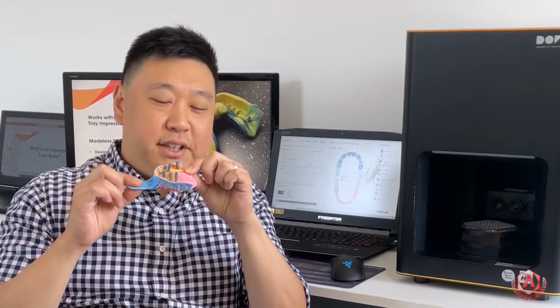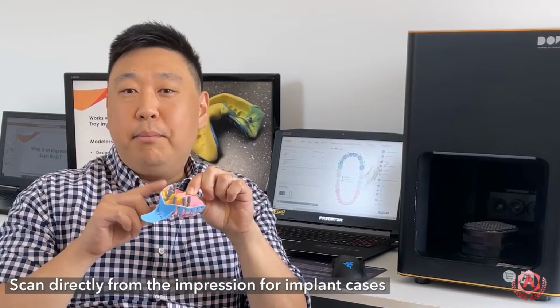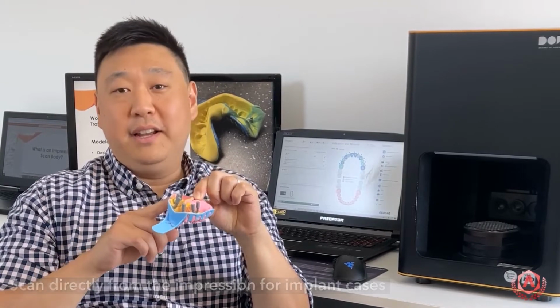Now you might be curious, what is an impression scan body? So for technicians, when proceeding through the digital route, you would either receive maybe a digital impression from your doctor or maybe a physical impression itself. Now really with those cases, you would have to pour up your stone model and then proceed with scanning from there using standard scan bodies. These scan bodies give you the ability to actually scan directly from the impression itself for your implant cases.